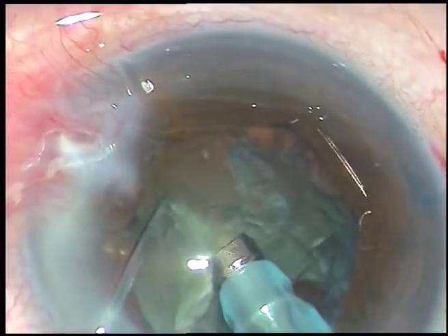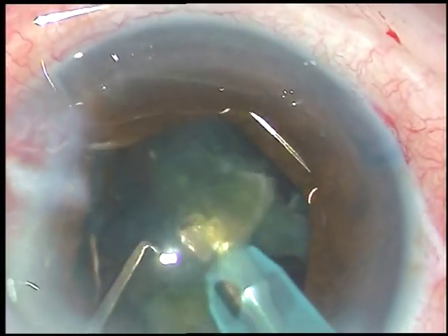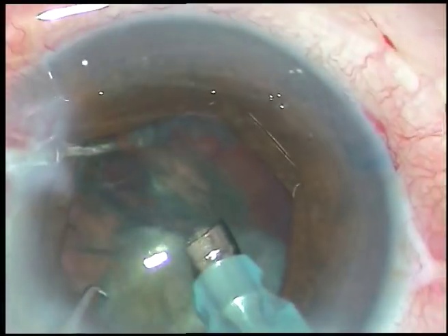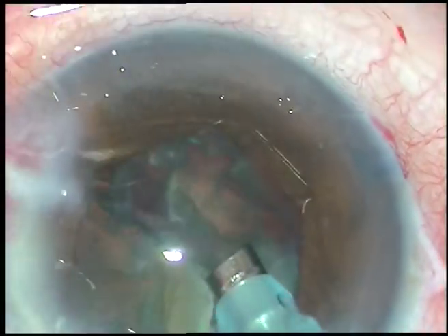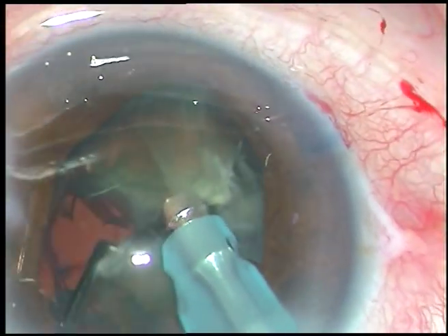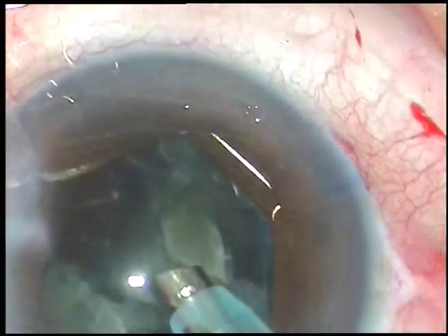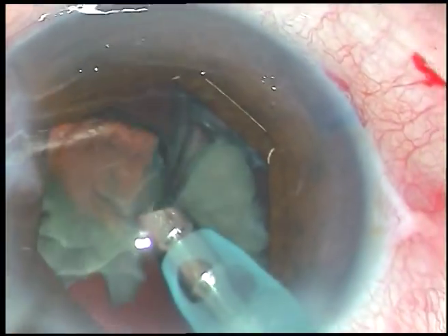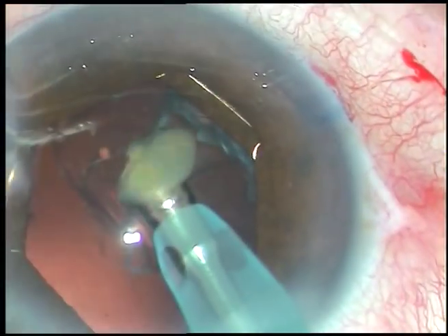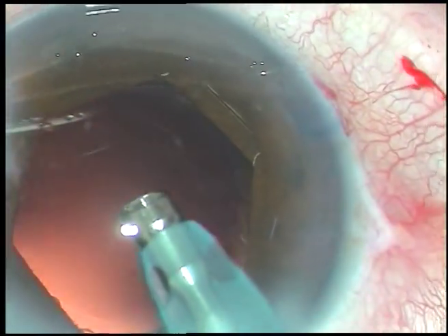FACO power used in this case is 60%. Flow rate is 45 ml per minute. Vacuum is 450 mmHg. This is the last fragment — it is being subdivided into two parts and each part is emulsified and removed. During emulsification of the last fragment the chopper is taken out. And this is the epinucleus.